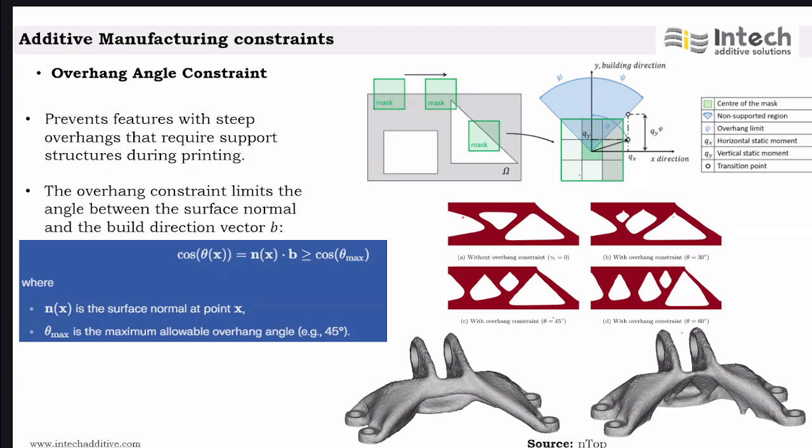So what is happening is I am designing some parts to basically avoid the overhang features. For example, you can see what is conventional optimization that has been done, where you have overhang regions which require support structures.